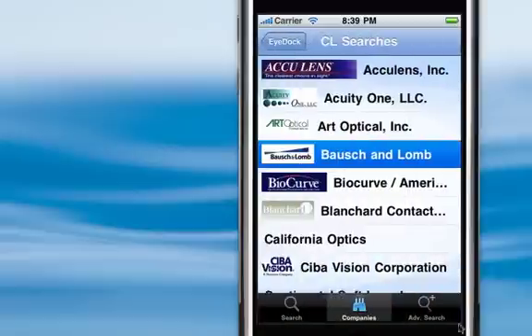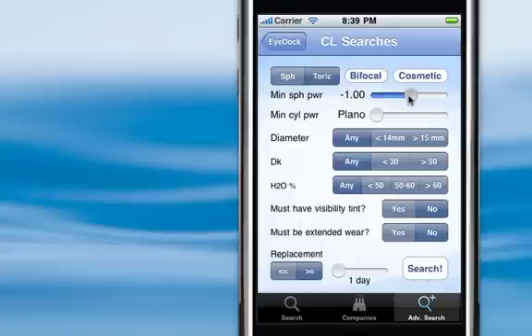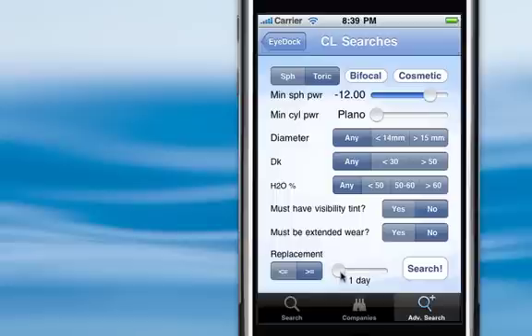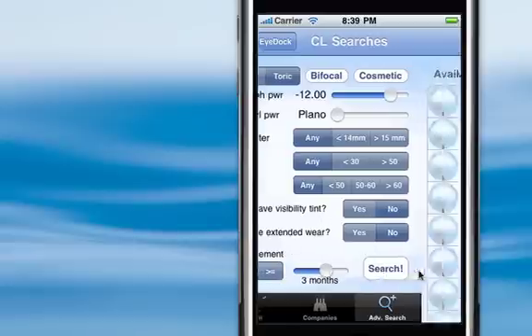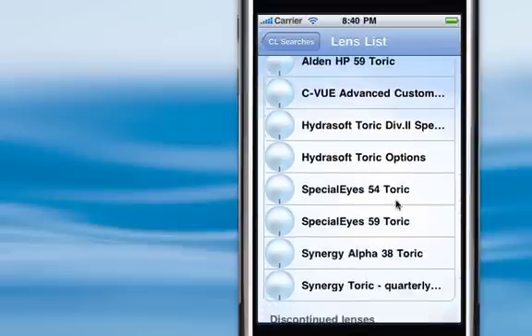And lastly, there's an advanced search option too. So if you are looking for a toric lens that comes in a high minus power and you want it to be a three-month or less replacement lens, you can set those parameters, hit search, and it'll find all the available options.